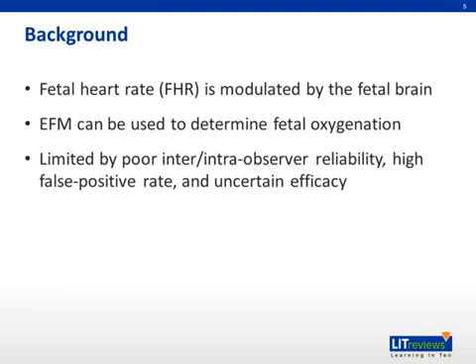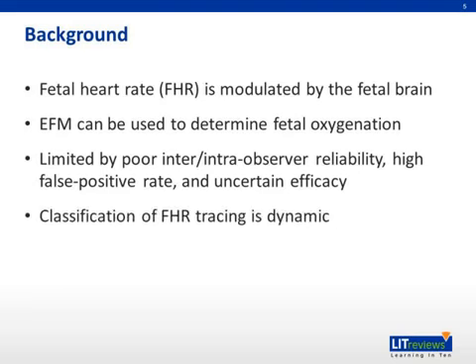Specifically, the inter-observer reliability of fetal heart rate tracing interpretation is poor at 21 to 29%. It is greater if it is a normal tracing. If the fetal outcome is known, the interpretation is likely to change. Please remember the classification of fetal heart rate tracing is dynamic. The classification can change depending on the clinical scenario and management.